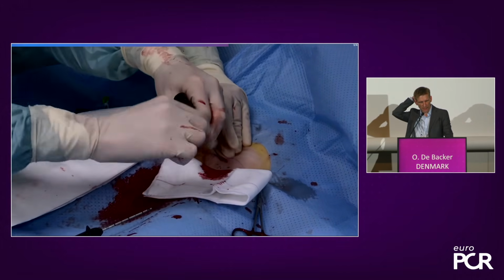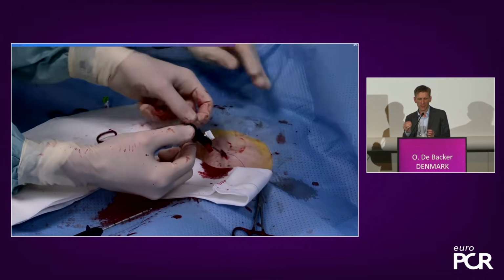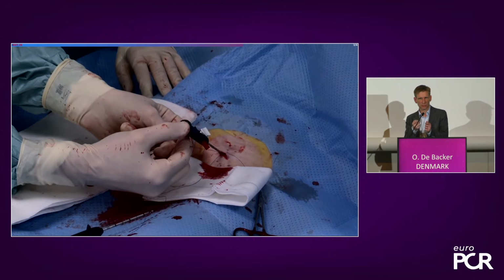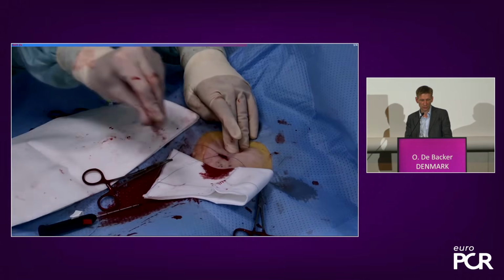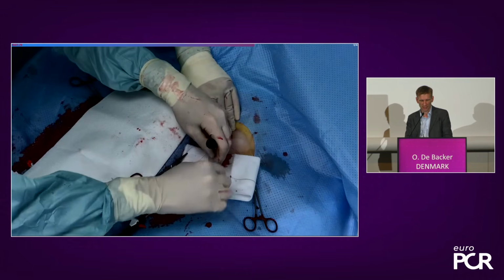So I think the only thing that I do now additional, I repeat it on both, and then to lock my suture, I pull also on the short end. As soon as you pull on the short end, you completely lock the knot, so then you can't push the knot lower down anymore.